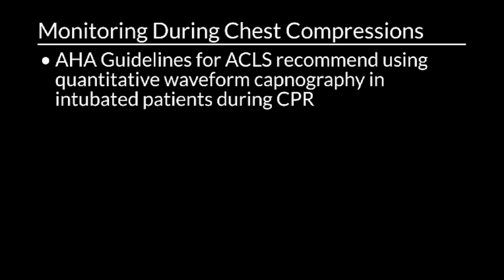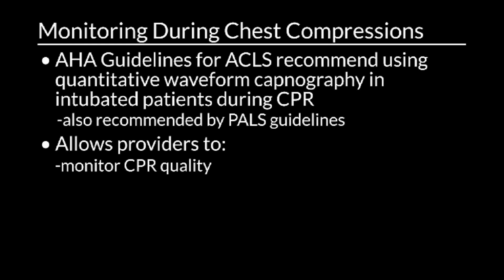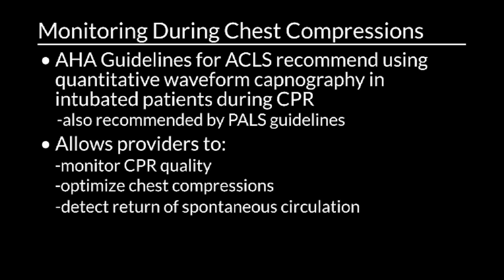Another important use for capnography is for monitoring during chest compressions. The AHA guidelines for ACLS recommend using quantitative waveform capnography in intubated patients during CPR. PALS guidelines also recommend using capnography for this purpose. This allows providers to monitor CPR quality, optimize chest compressions, and detect return of spontaneous circulation.